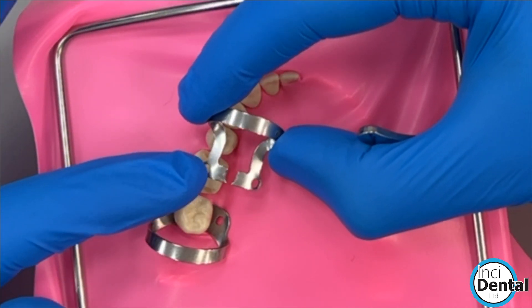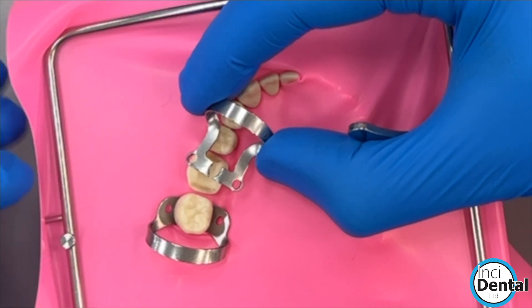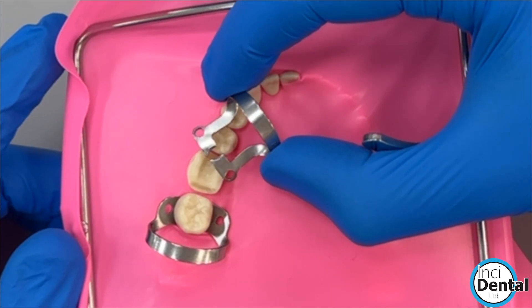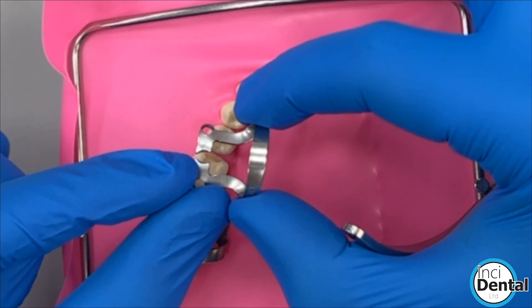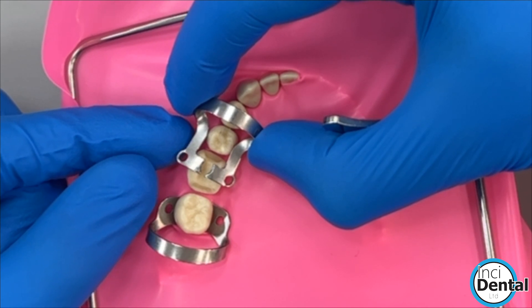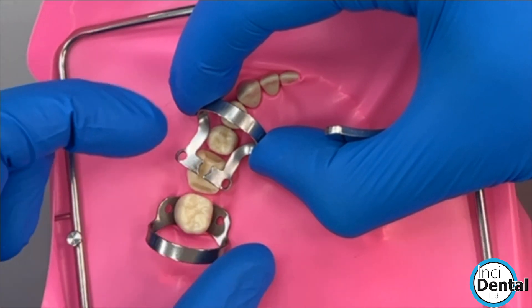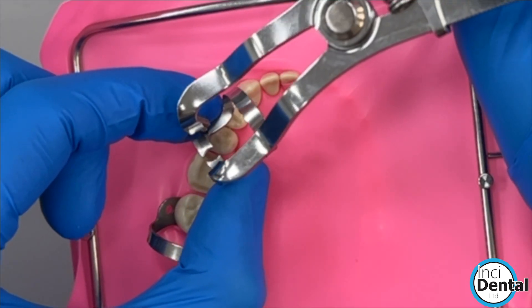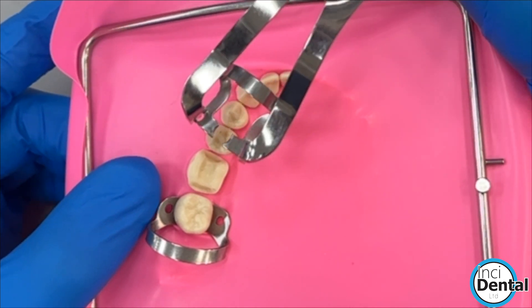The features of the clamp are that it's got a very flat and long arm to the bow, and that allows you space to do your cementation and to floss your contacts. The tines are offset, and you'll see that when it gets placed mesially — which is how it's designed — it sits very evenly with a nice four-point contact on the tooth, whereas something like a B4 or cut B6 doesn't give you that nice fit without modification.